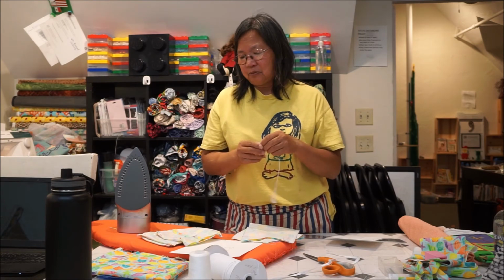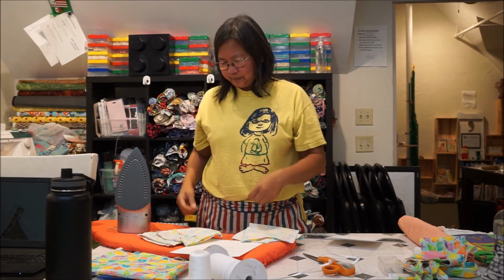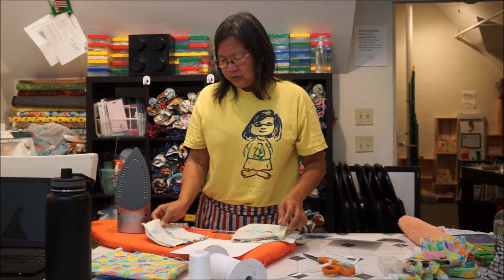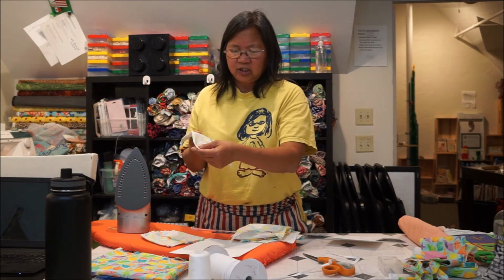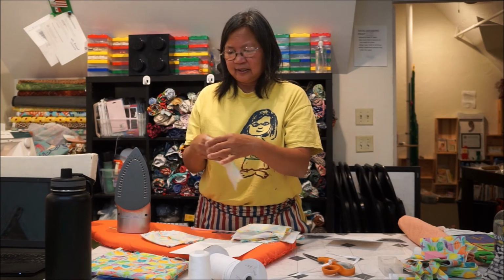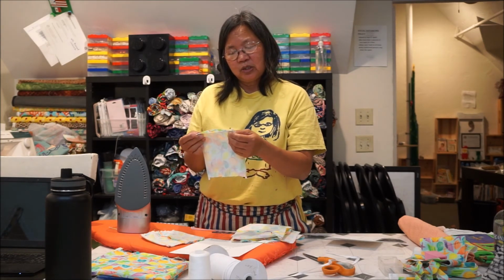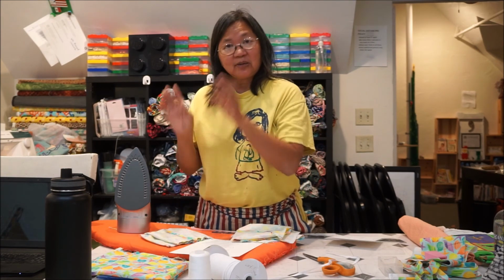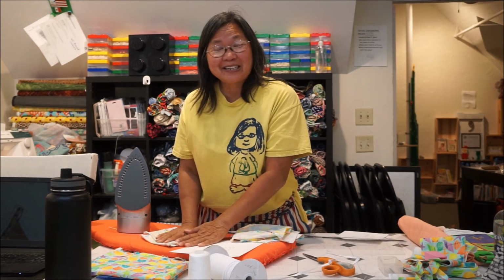And I tie a little knot on either end, and what that does is it prevents it from coming out very easily when I stitch over it. So this is a version of the stitched mask, and I have one end stitched, and I'm going to stitch the other end with you, and then we will pleat it and finish it, and that'll be the mask. But first I'm going to recut this video so we can get close-ups.